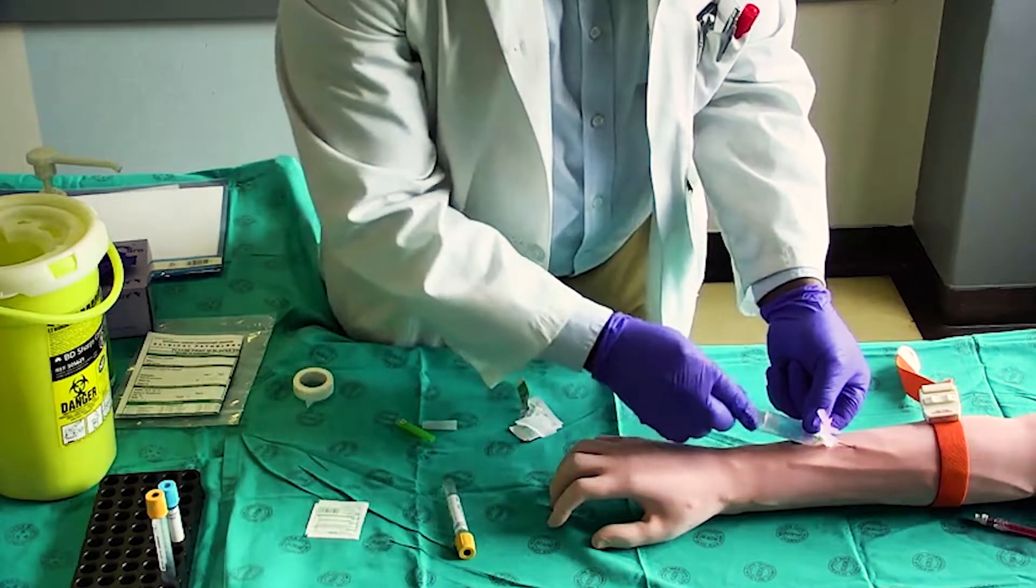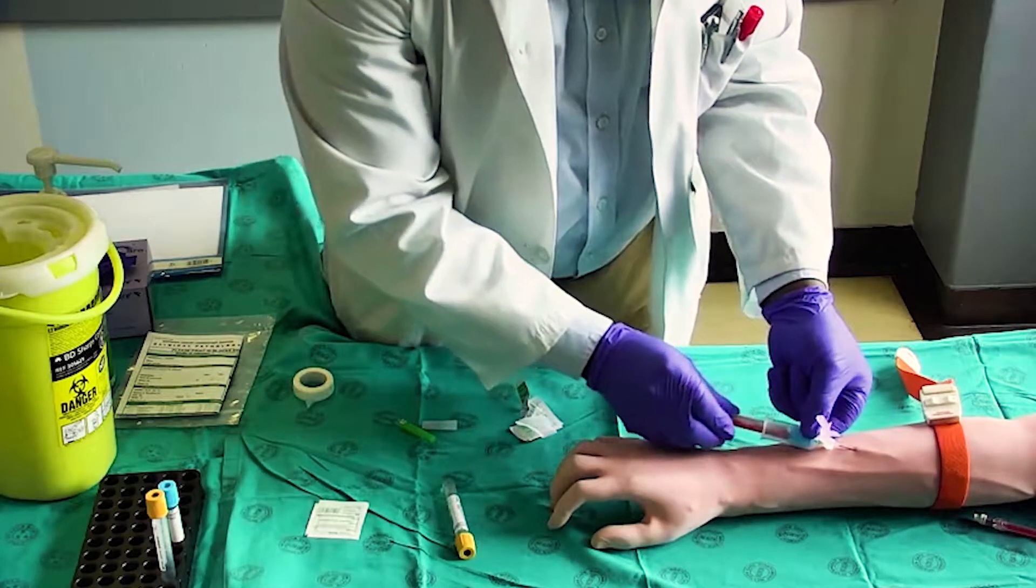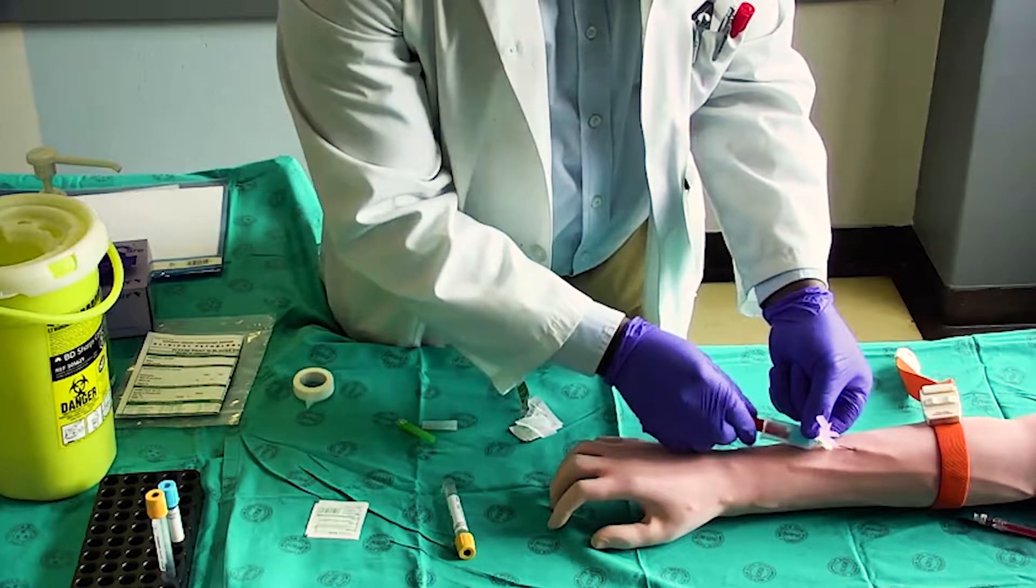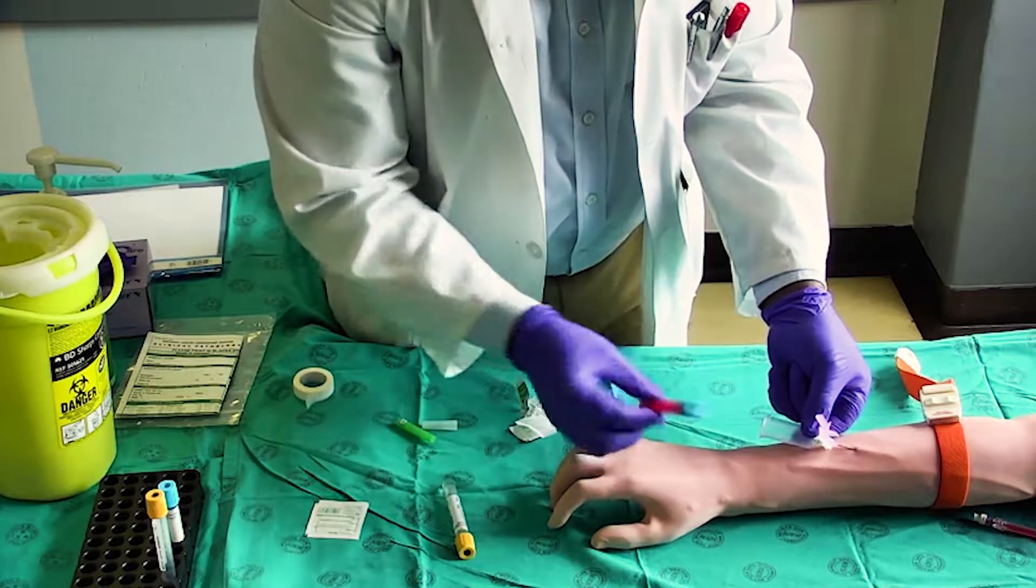Steady the barrel with your non-dominant hand whilst gently inserting a tube into the barrel. Allow the tube to fill with blood and remove once the tube is appropriately filled.